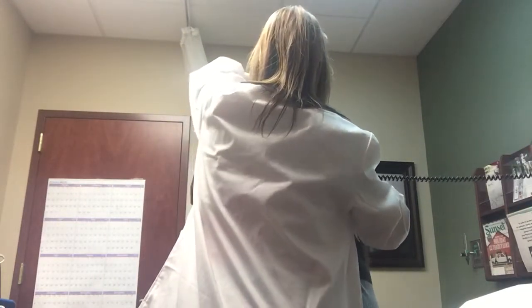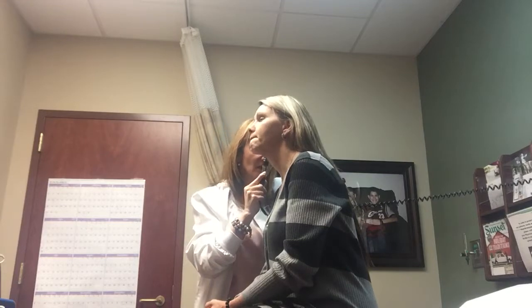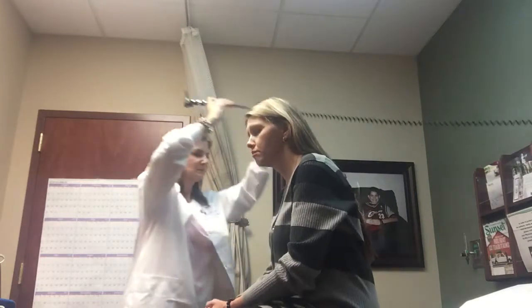So now I'm going to look inside your ear with a light just to look at your eardrum. So I'm going to pull your ear up and back just a little. And I'm looking in there to see if you have any earwax in there, any cerumen, any redness, or any lesions, or how your eardrum looks. And your eardrum looks good. Your eardrum is kind of a grayish color, and it's not bulging, and it doesn't look red or anything, so that means there's no infection in there, no fluid behind your ear. There's no perforations. I don't see anything in there that looks like you have had any ear infections that have ruptured your eardrum or anything like that.